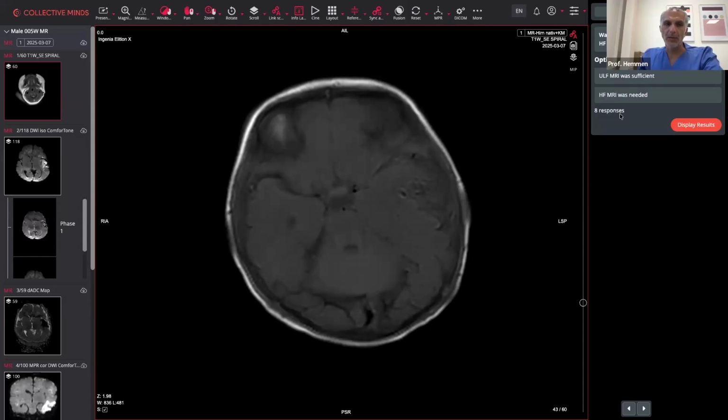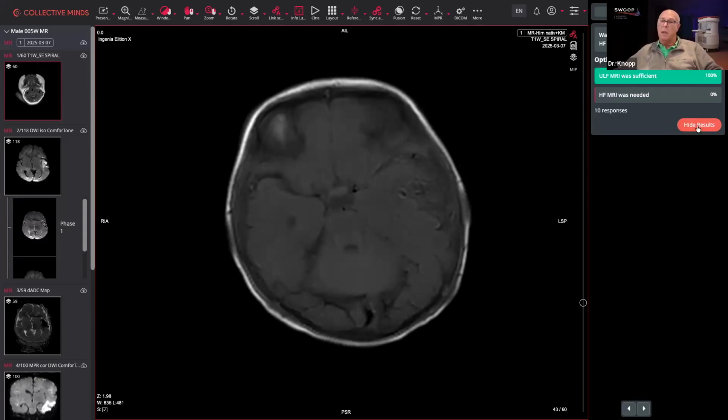And that's what we thought here. Of course, we did the 3T, but we did follow up low field images, which is, of course, then the big benefit that we have, that we can do serial imaging and say, okay, let's look after an hour, after 2 hours, after 5 hours, after 10 hours, or whenever anything changes clinically, then you can also, with minimum amount of work, rescan compared to if you would like to rescan on 3T. Clearly the advantage of the portable MR.